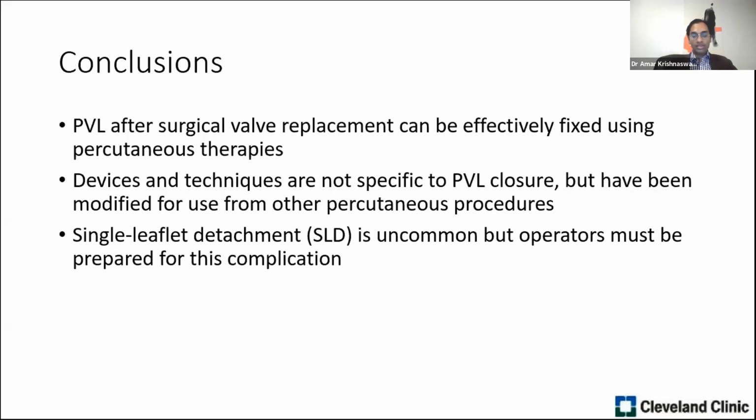And while single leaflet detachment with MitraClip is uncommon, it can happen about 3 to 5% of the time. And so operators really must be prepared for this complication. The treatment, I think, depending on the etiology, can be percutaneous or surgical.